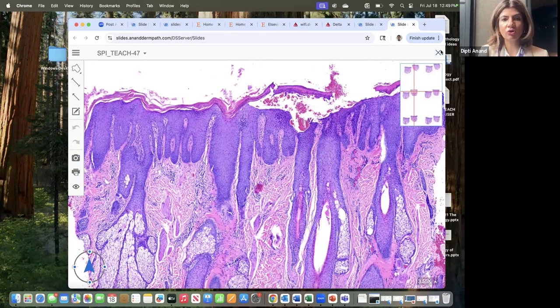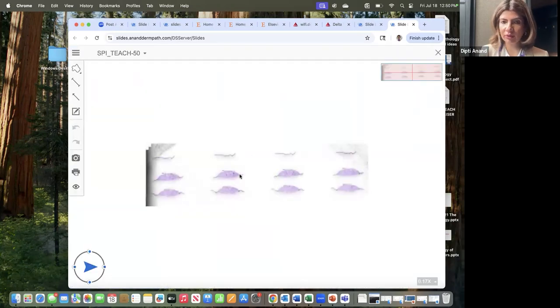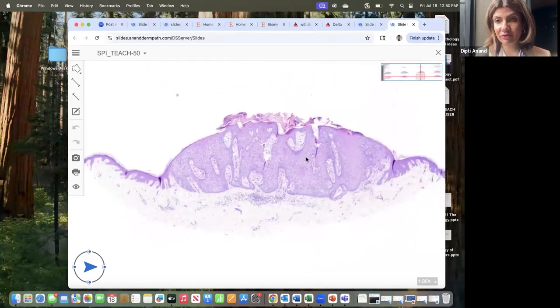Okay. So the next, however, important question that they do like to ask you is a pale cell acanthoma. So a pale or clear cell acanthoma is a solitary lesion, which is a mimicker of psoriasis under the microscope, but clinically it's not. Clinically, it is a solitary lesion, which looks like a juicy erythematous papule, and you clinically are thinking about a basal cell.